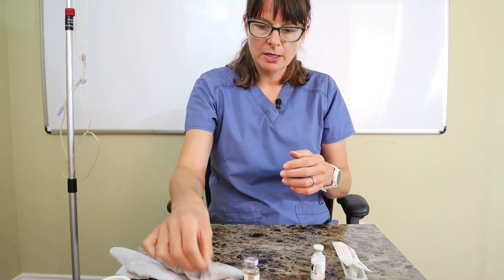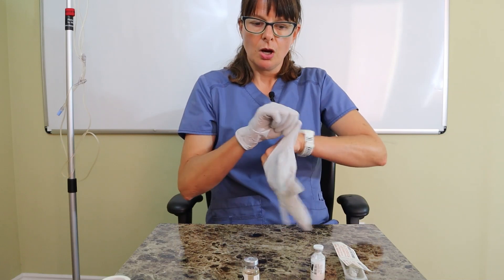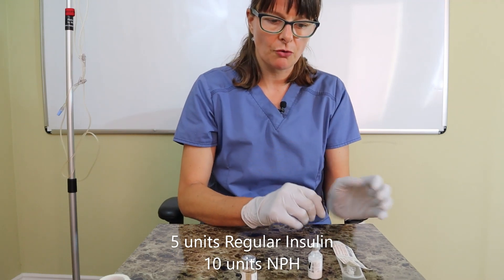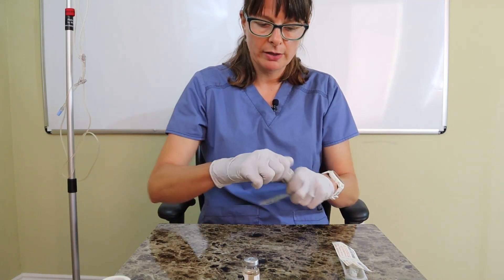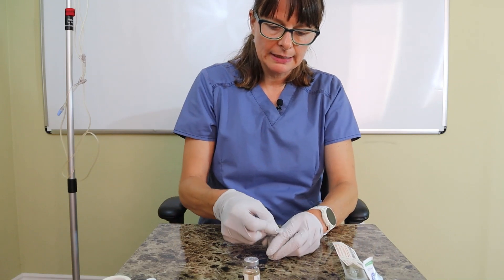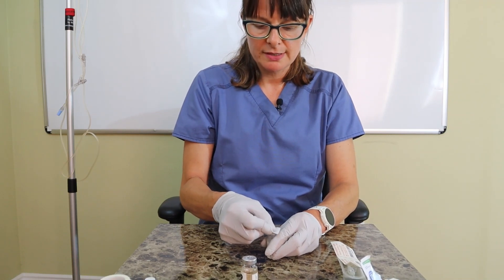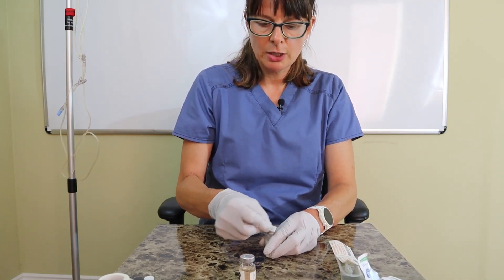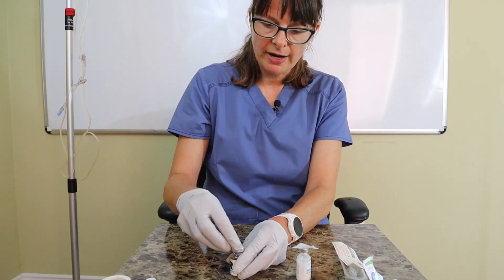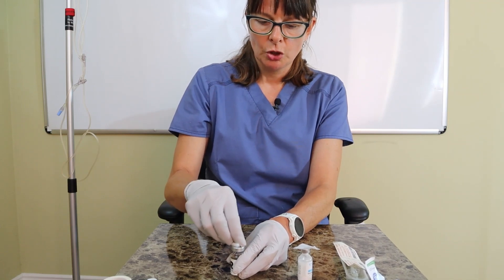Of course, I'm always going to perform hand hygiene and don my gloves. Today we're going to draw up five units of regular and 10 units of NPH. This is a brand new vial, so I'm going to open up the cap, use my alcohol wipe, and clean the top of the rubber stopper vigorously for about 10 to 15 seconds. I like to keep the alcohol wipe on top and use a second one to clean the other vial, so I know which one is ready to go.